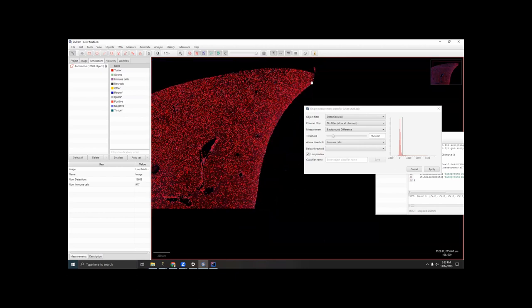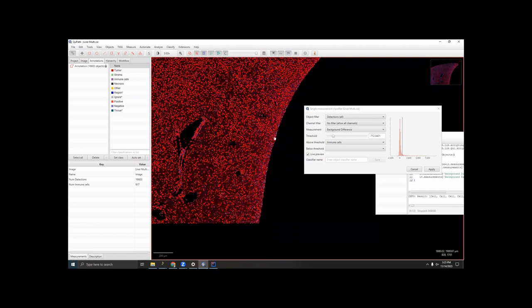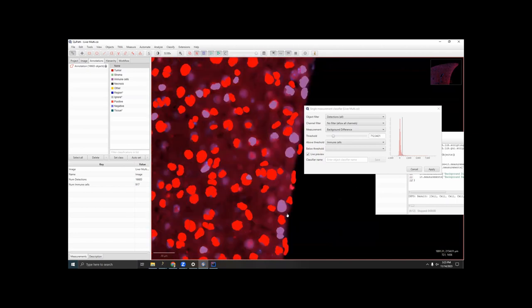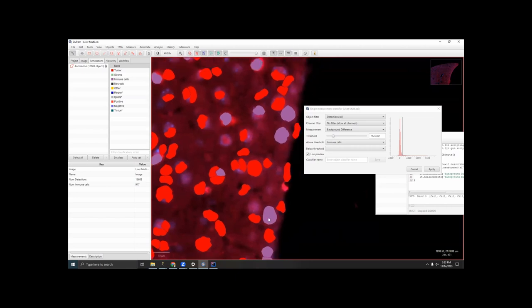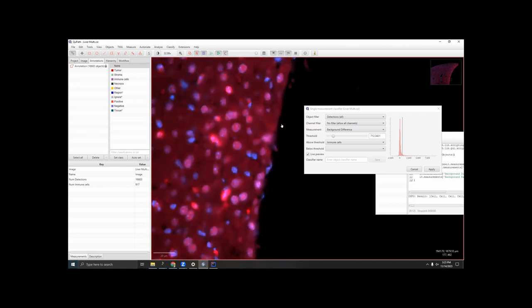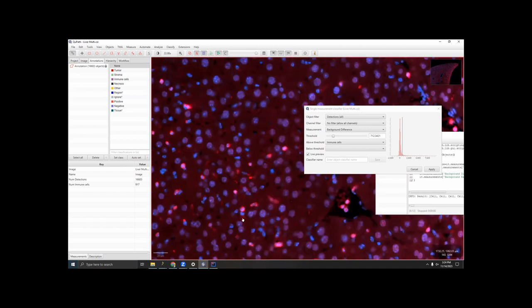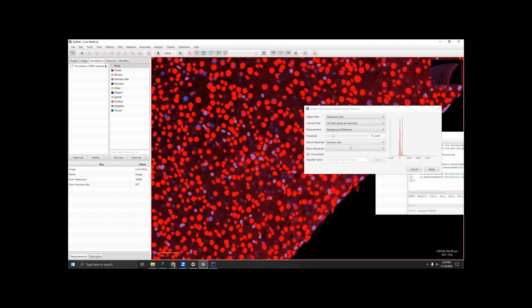If you zoom out, you can see that there's still a line of classified positive cells right at the edge of the tissue. These are often false positives, and that's because when it's doing that 25 micron diameter circle, it's getting some of this true negative, like true black background, and that's affecting the calculations of the background intensity. So this isn't a perfect method. As I mentioned, it's always better to fix your sample prep than to try to math your way out of an artifact. But at least it's far more accurate than it was.